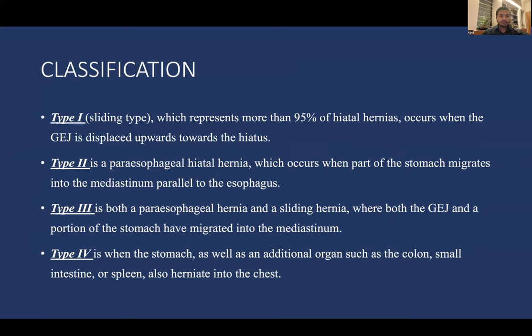Classification: Type 1 is the sliding type, representing more than 95% of cases, occurring when the gastroesophageal junction is displaced upwards through the hiatus. Type 2 is the paraesophageal hiatus hernia, where part of the stomach migrates into the mediastinum parallel to the esophagus. Type 3 involves both paraesophageal and sliding hernias, where both the G-junction and part of the stomach have migrated into the mediastinum. Type 4 is when the stomach as well as an additional organ such as the colon, small intestine, or spleen also herniate into the chest.